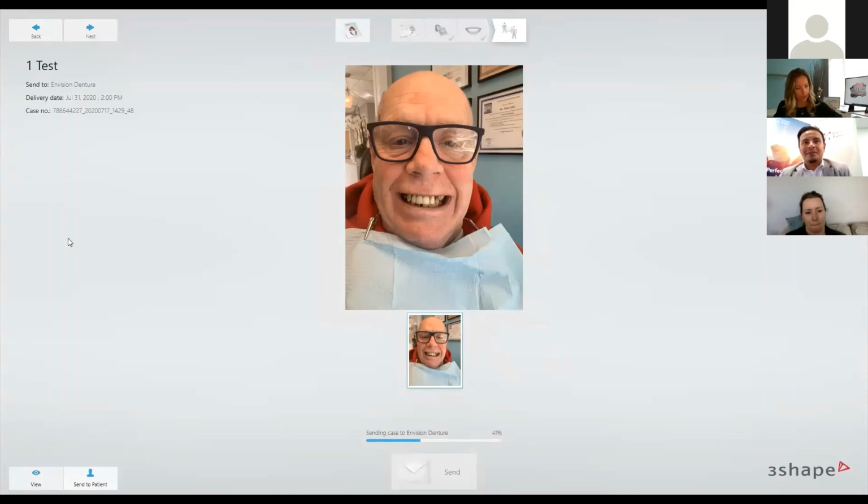Am I missing anything, Eric? Actually, no. What I like is that when we started, I remember it required a scan to be able to send. Now it doesn't require it anymore. They've updated the software with the most recent version to be able to do that. So that's actually really cool.